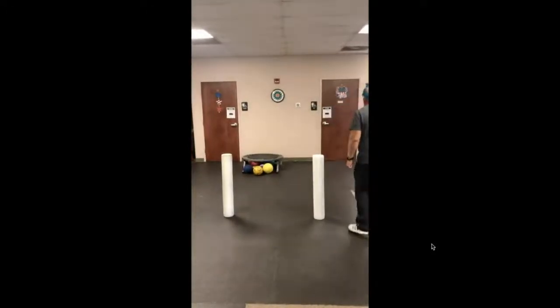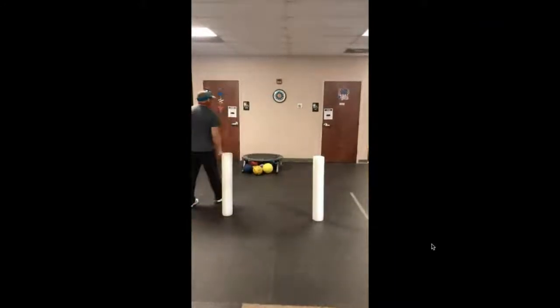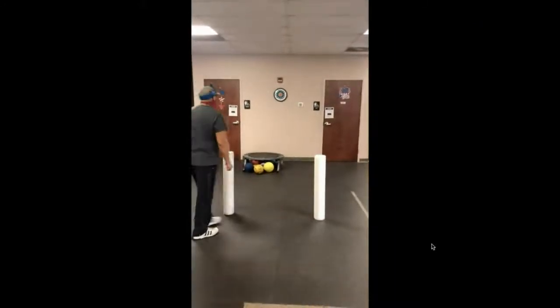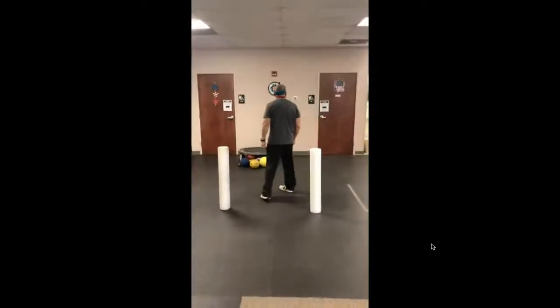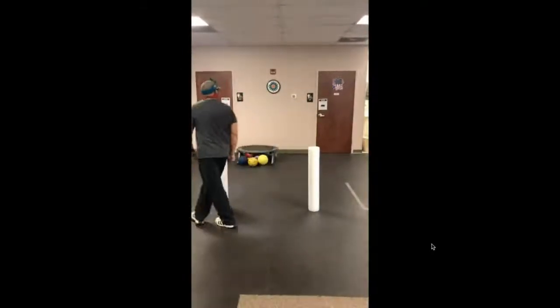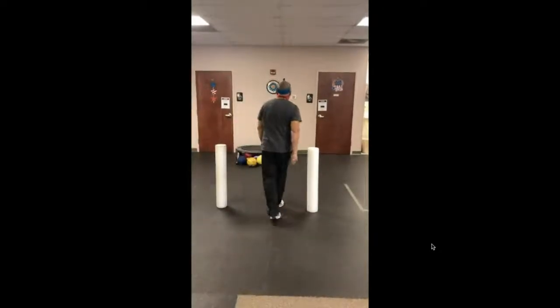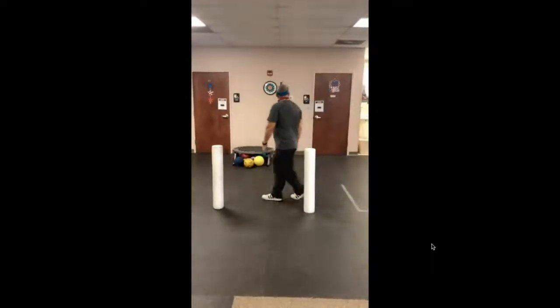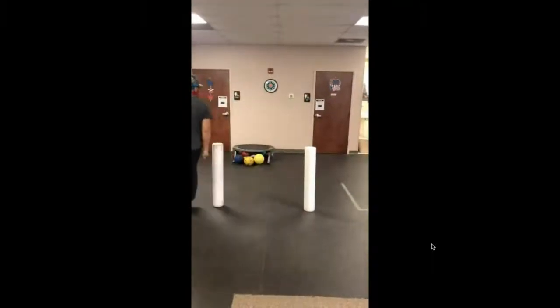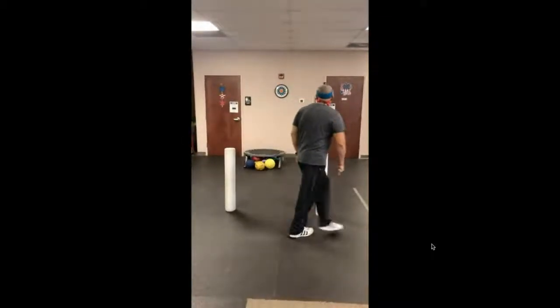So you can see if they start to visually cheat pretty easily because the laser will drop down. You've seen that already once, and we'll watch this video again. But they just keep that centered up. They're going to be able to see with their peripheral vision where they are around those targets. And there's a consequence for these particular targets. So if you rub into the foam rollers, we'll talk about that in a second. They could knock those over pretty easily. It's going to give them a sense of motivation to not do that.